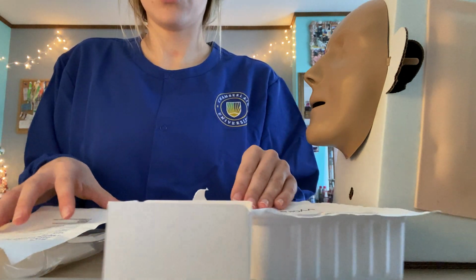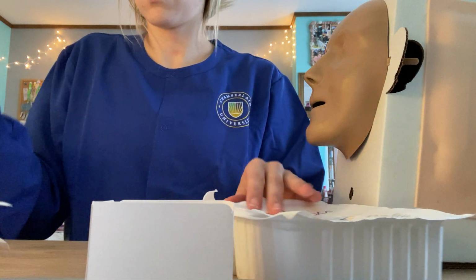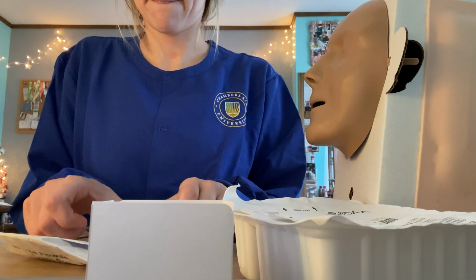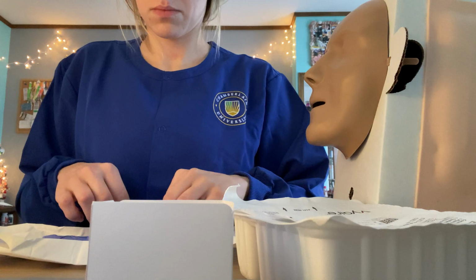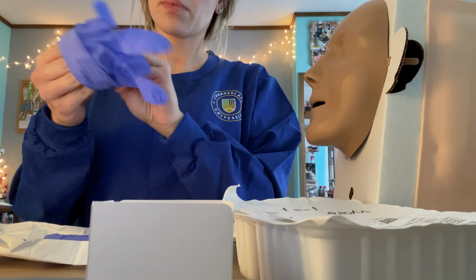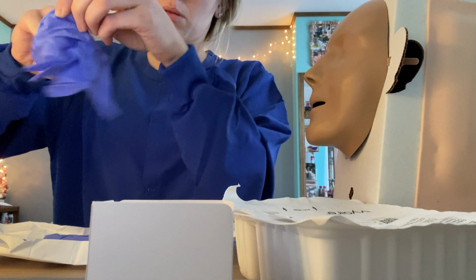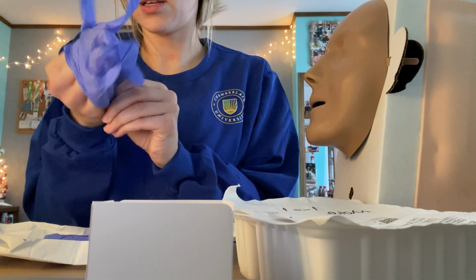Then next what I'm going to do is don my sterile gloves. Oh my goodness.